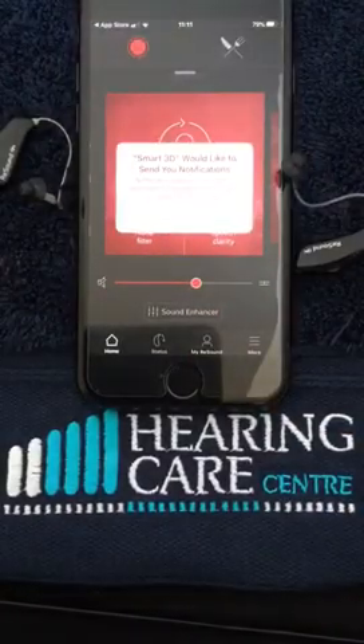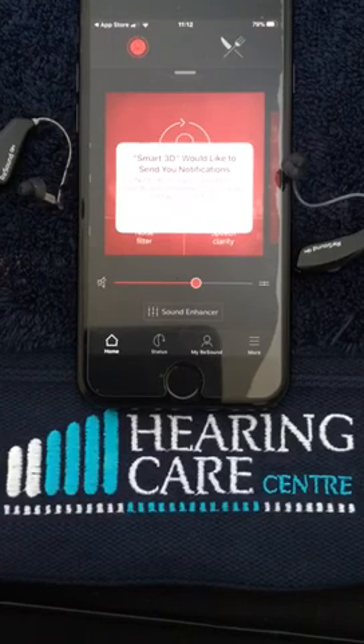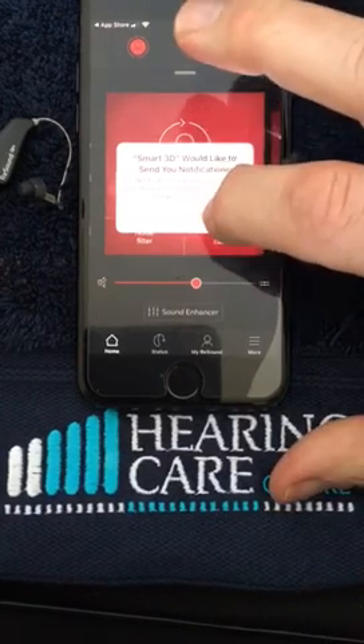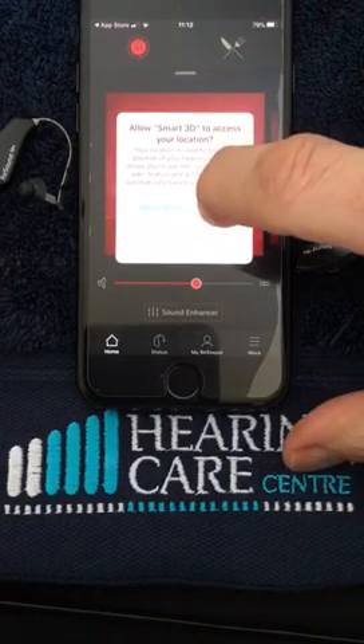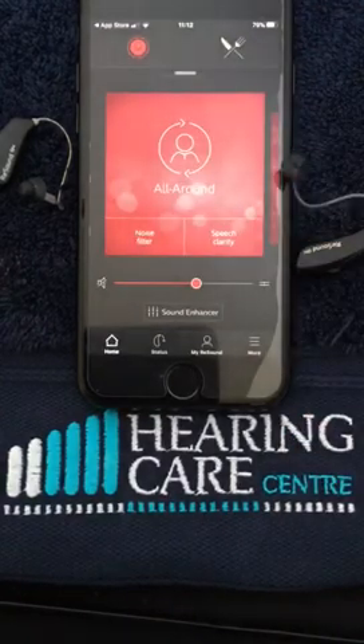It will ask us to allow notifications. I would suggest we do this for any updates that are available, and also only whilst using the app, so we click on that as well.